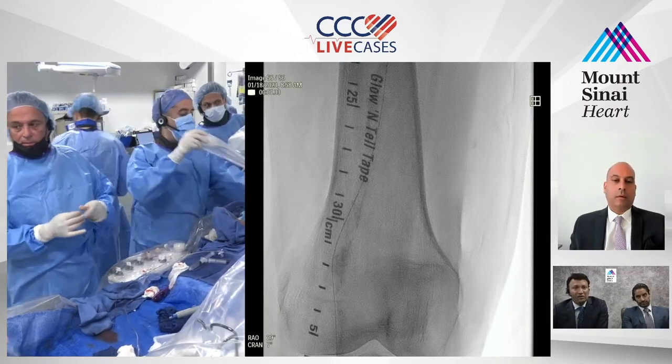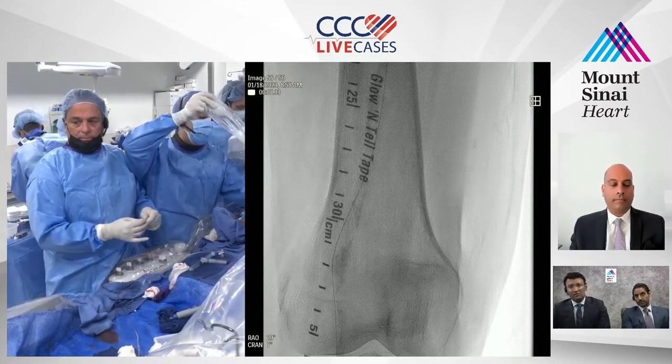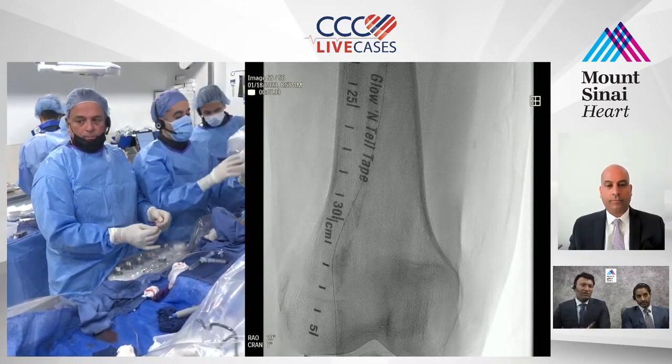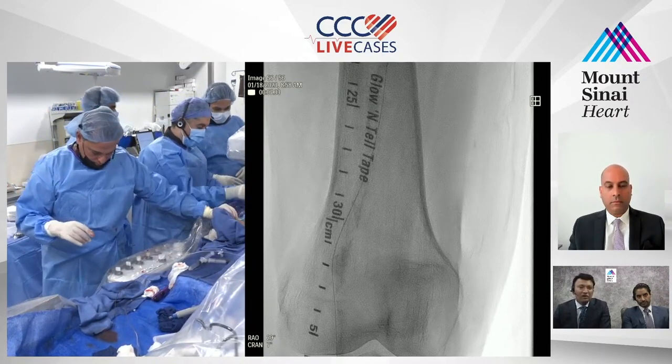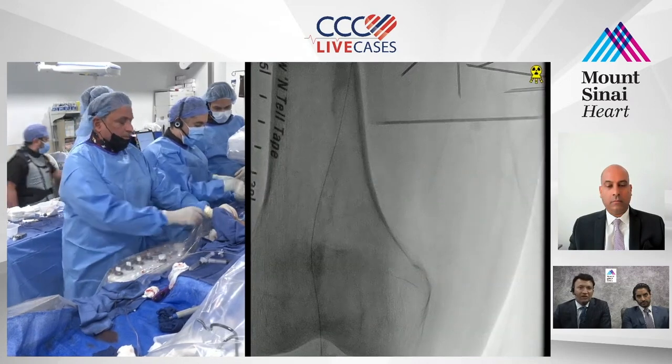But hopefully, right? If we cross, you're right, unless we cross in a different direction. I know, but it doesn't matter which plane you go in. With that amount of calcium chunk, you still have to make the track. We already ballooned it. We might as well just use this track.